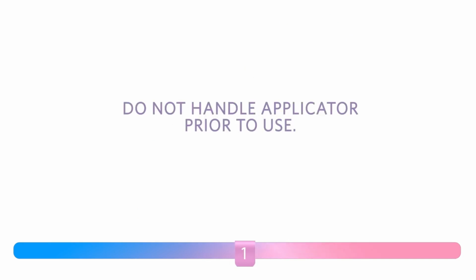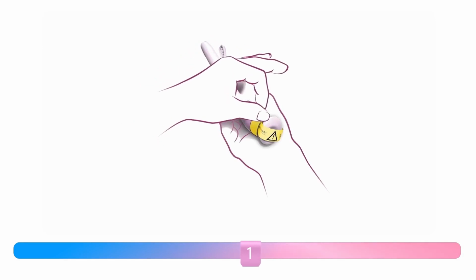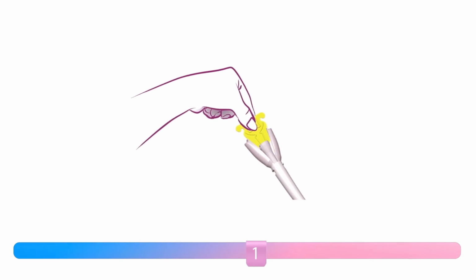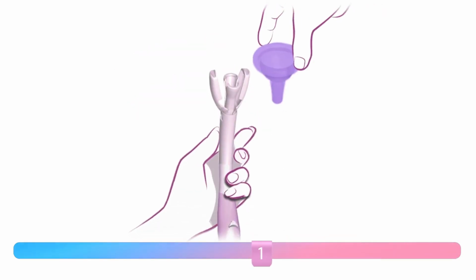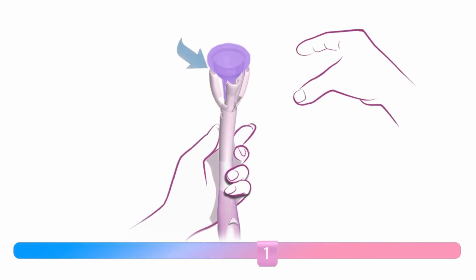Step 1. Remove the yellow shipping wrap by pulling on the tab. Place the cervical cap into the open cap holder as shown. Ensure the cap is in place.